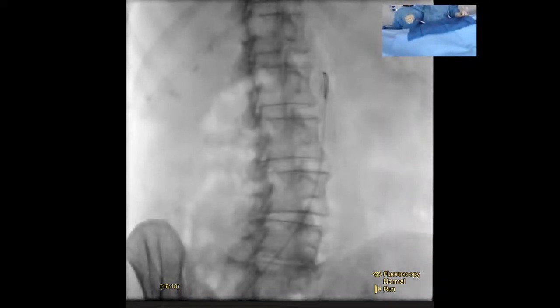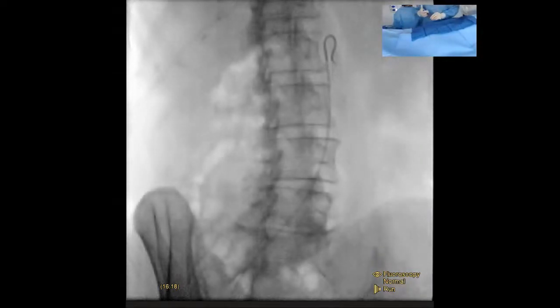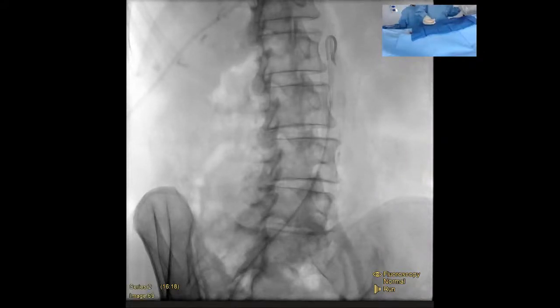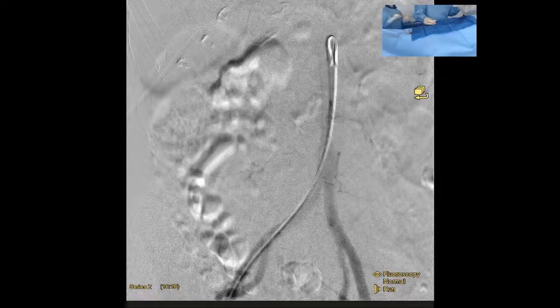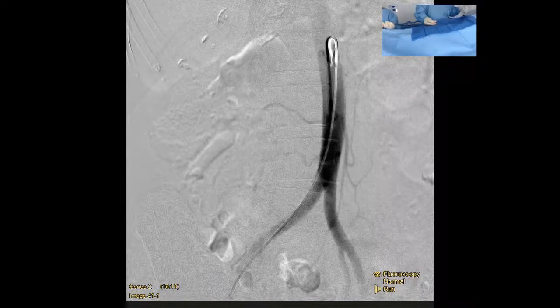So why don't you tell us a little bit about why we're doing this procedure today? Sure. This is a young woman who has hemorrhoids, and patients who either failed banding, or have not failed banding but have pretty significant symptoms where the GI physician may feel they are not a good candidate for banding, like they might need multiple bands. Then we often get patients referred for hemorrhoid embolization. So she's undergoing a hemorrhoid embolization.